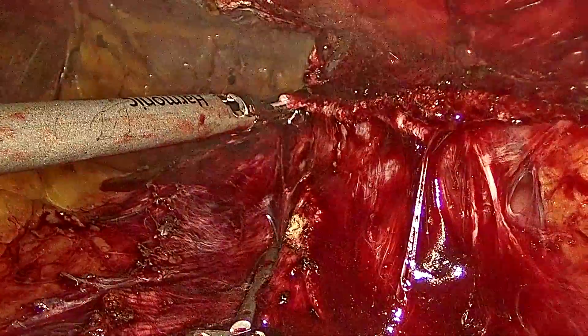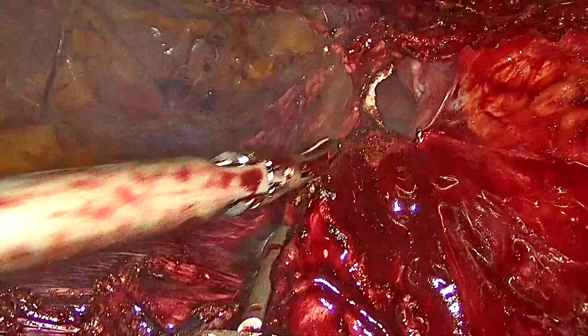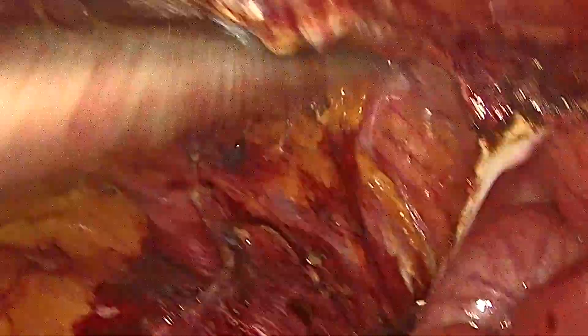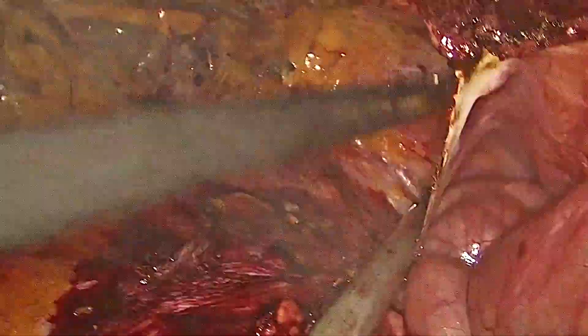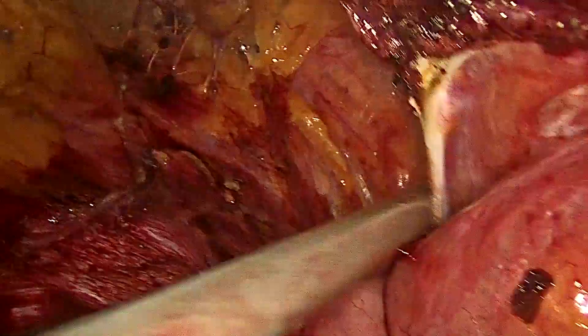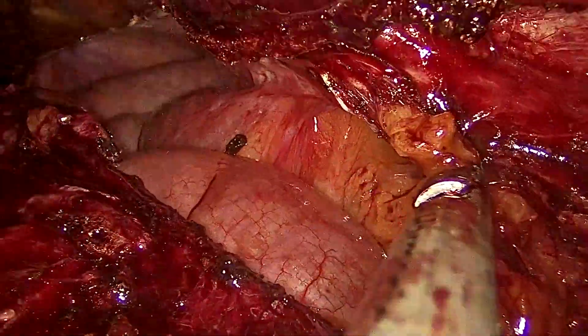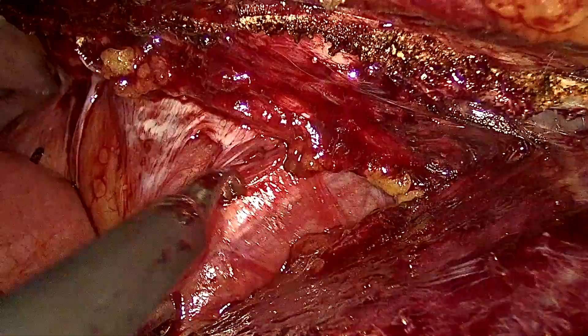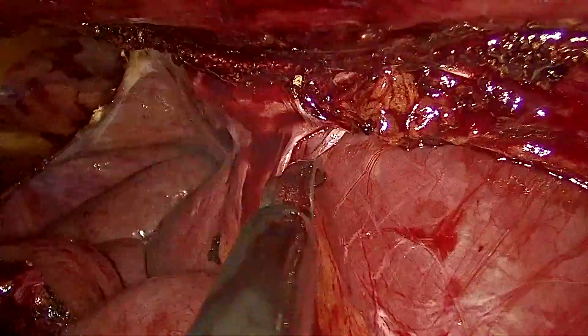Once the medial border of the defect is reached, the peritoneum is divided. We aim at preserving as much peritoneum as possible to facilitate posterior closure. Adhesiolysis is then carried out predominantly with cold scissors.